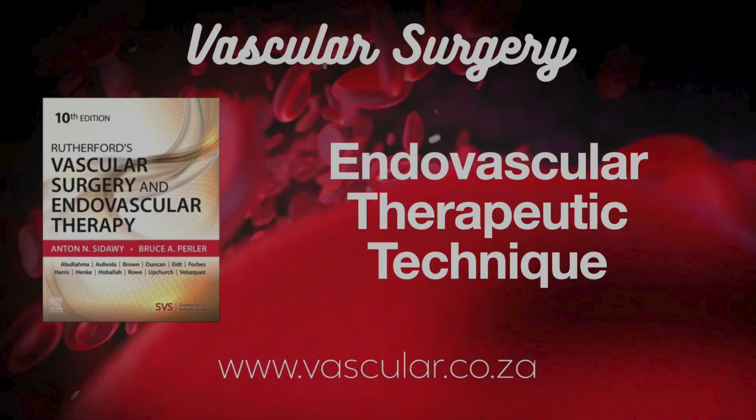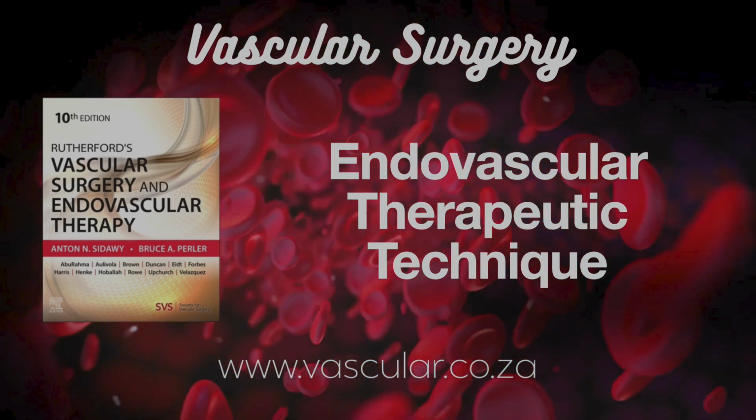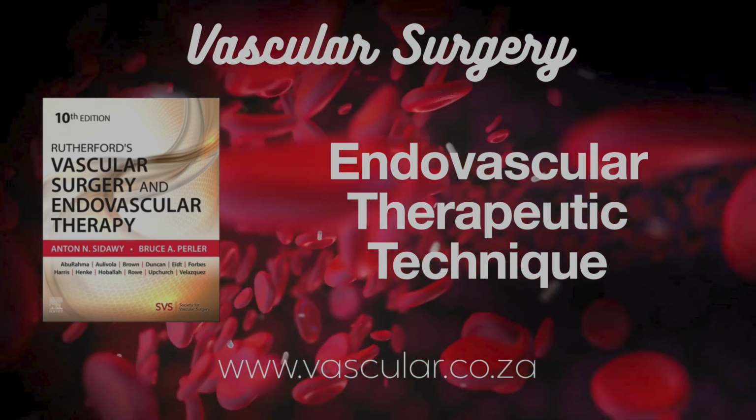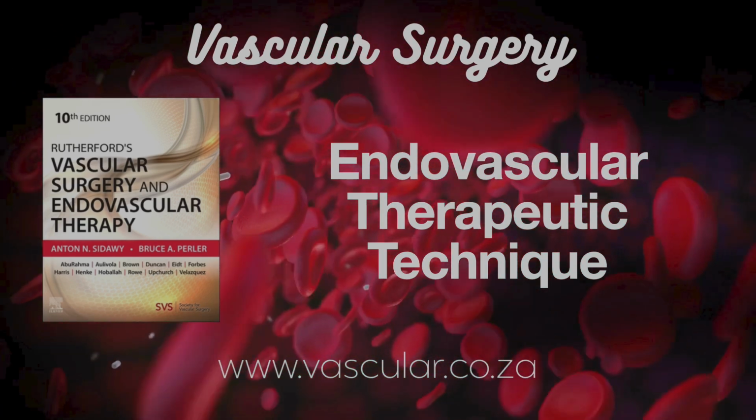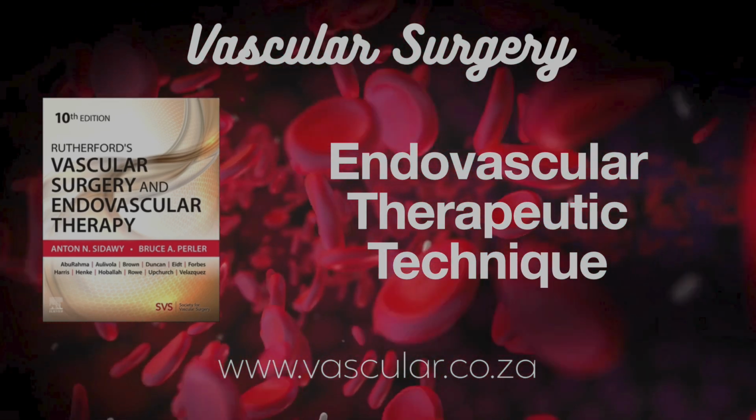Don't want to rupture it. Accurate measurement is key. Use angiography, CT, IVUS, sizing catheters. Balloon shaft length depends on access site and target location. Table 63.2 in the source lists sizes.